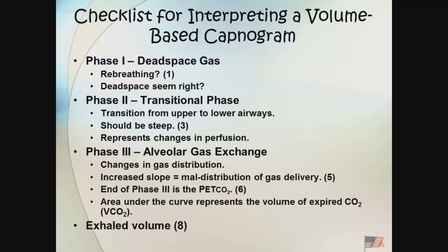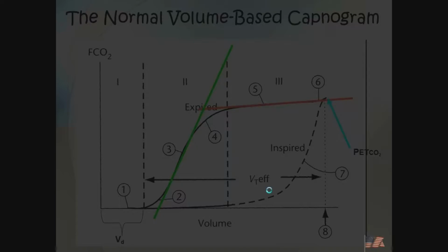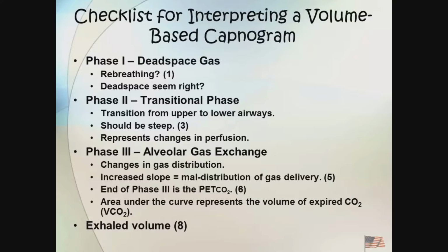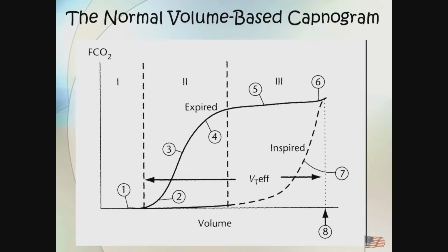And at the very end, we mentioned the end-tidal CO2. And notice that this entire area under the curve here, all of this portion here, is CO2 production. So you're quantifying how much CO2 is being exhaled. So we can actually measure CO2 production, where prior we didn't have that ability, now we do. Because I'm not only measuring the exhaled CO2, I'm measuring the volume of gas that is being exhaled also. So there's our curve and our two lines.